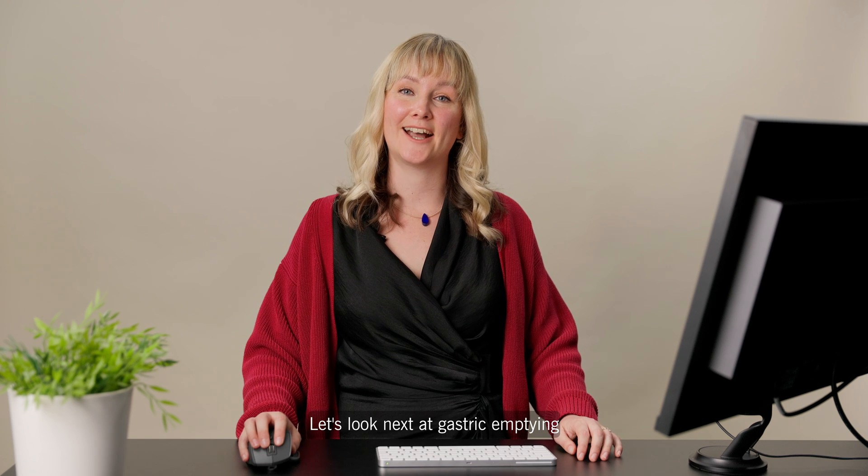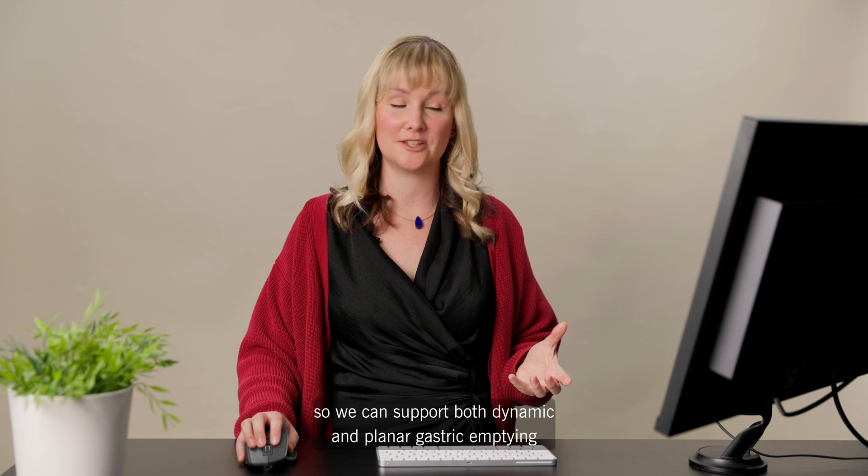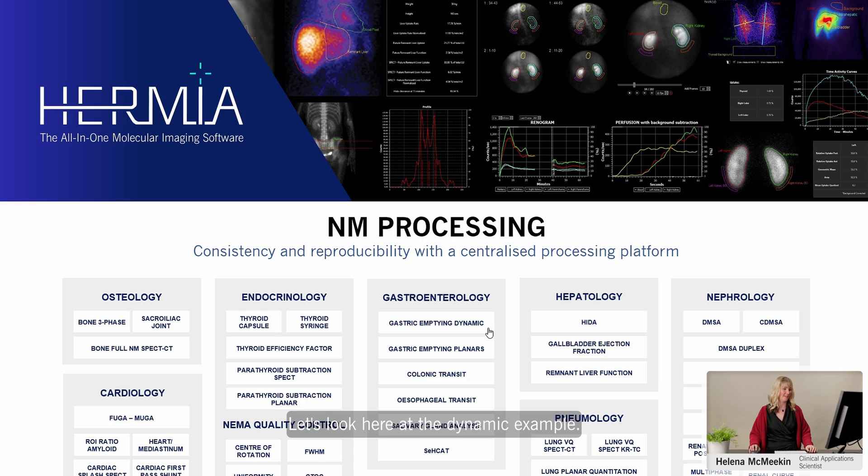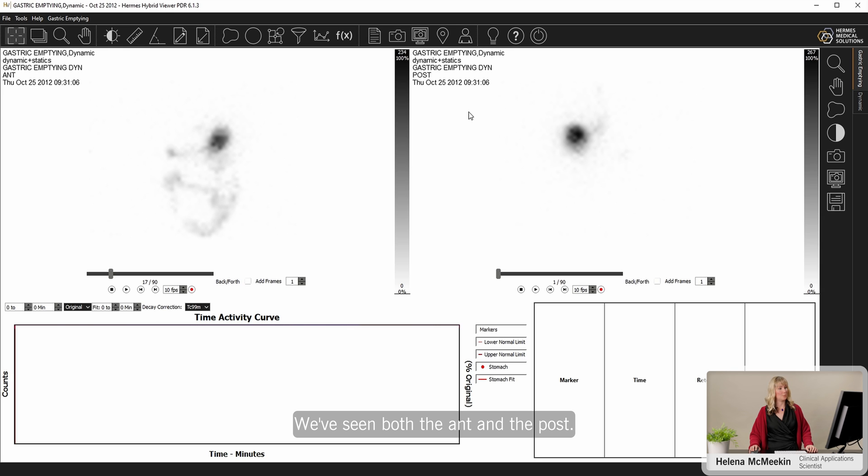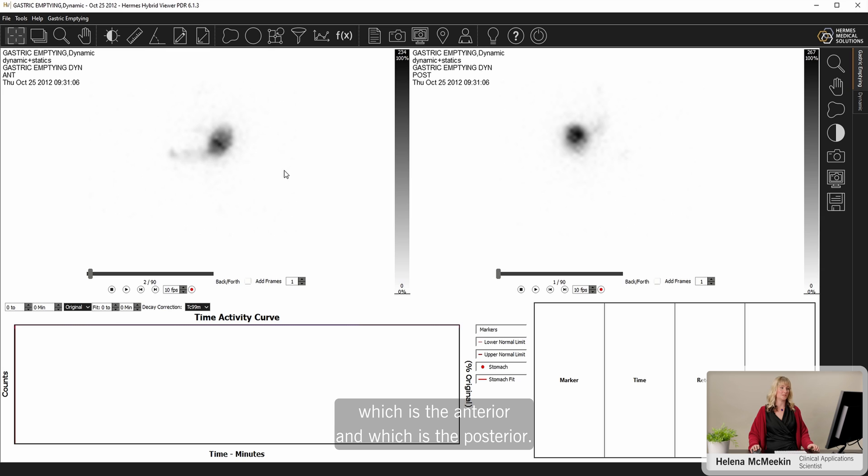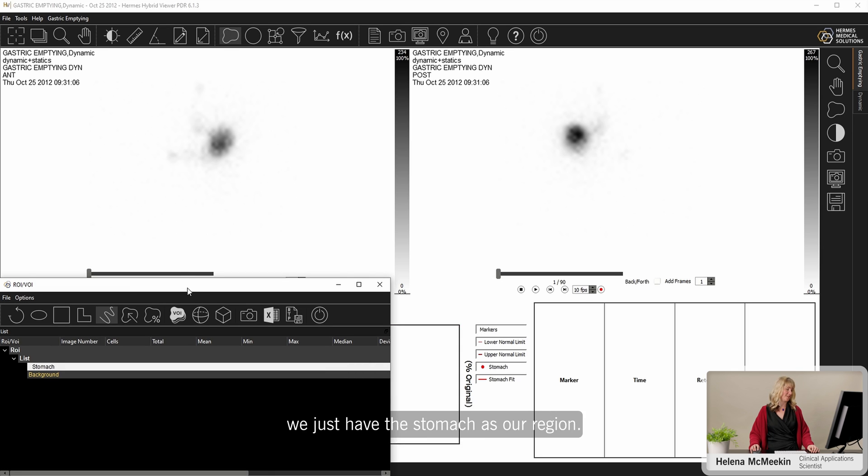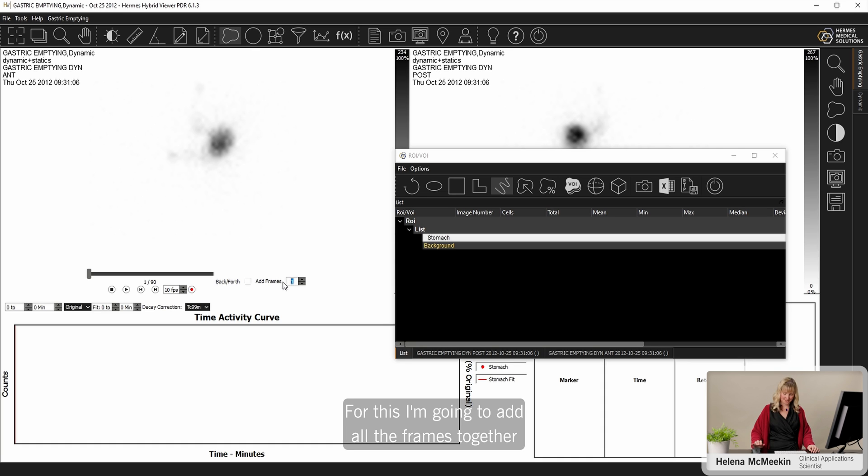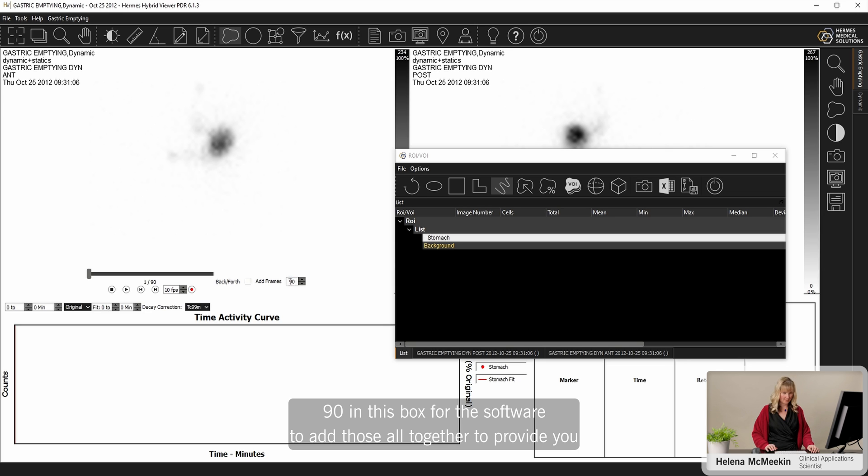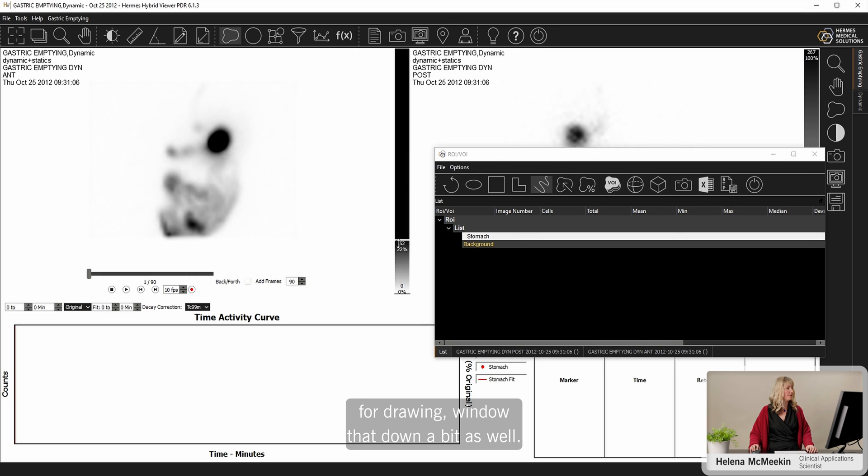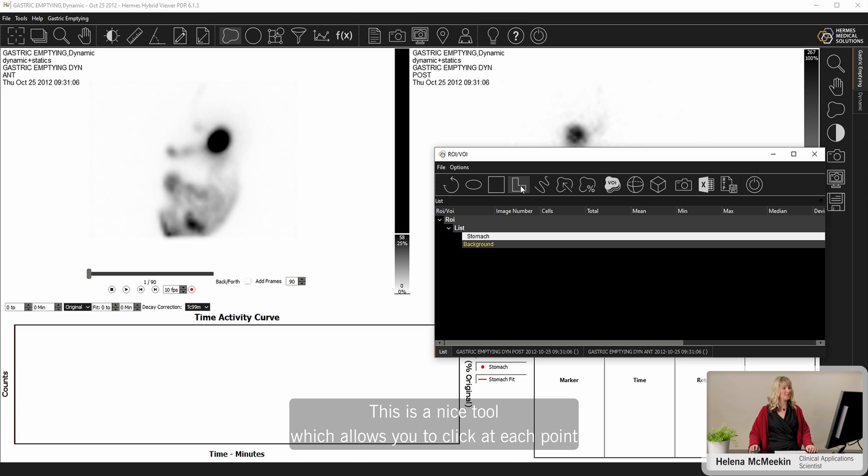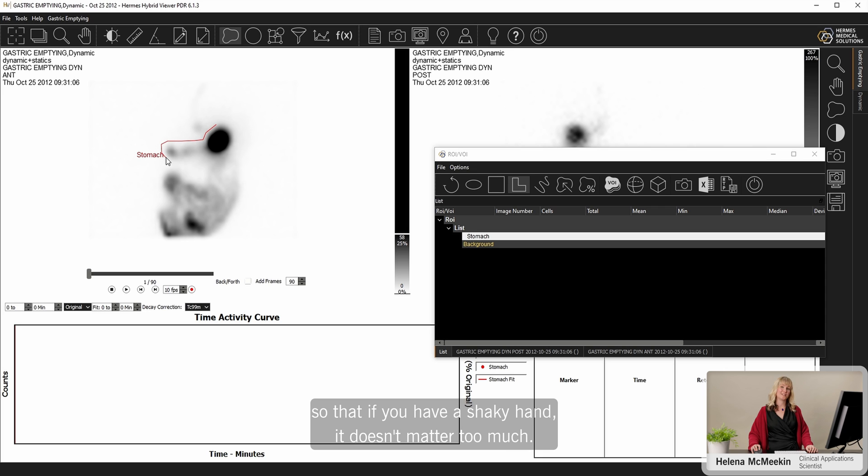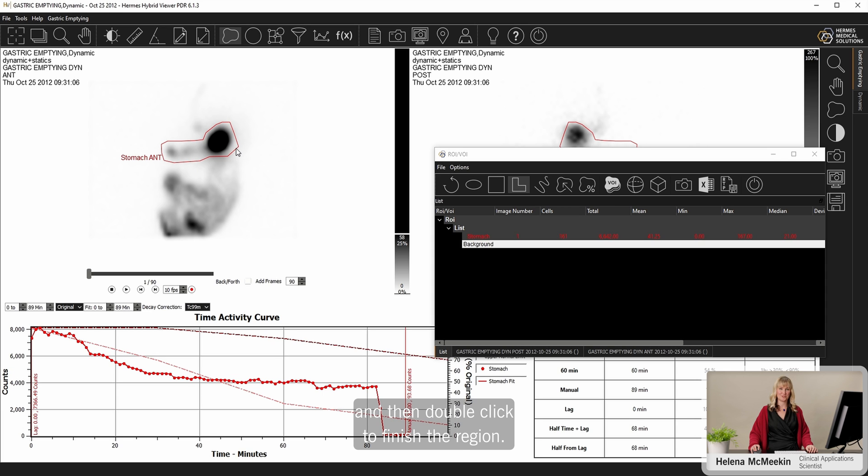Let's look next at gastric emptying. So we can support both dynamic and planar gastric emptying, or a combination of both. Let's look here at the dynamic example. So we have our dynamic gastric emptying scan here. We've seen an ant and a post. Again, the software has recognized on the way in which is the anterior and which is the posterior. So we're going to draw some regions. We have the same tools as before. We've got a zoom and a pan and some regions. This time we just have the stomach as our region. For this, I'm going to add all the frames together. So I can see we've got 90 frames in the scan. So I'm just going to type in 90 in this box for the software to add those all together to provide you with an easy way of seeing the full extent of the stomach for drawing. Window that down a bit as well. And then we can use the freehand tool maybe, or this rubber band tool. This is a nice tool which allows you to click at each point that you want to change so that if you have a shaky hand it doesn't matter too much. But you can just click where you want to define your region and then double click to finish the region.